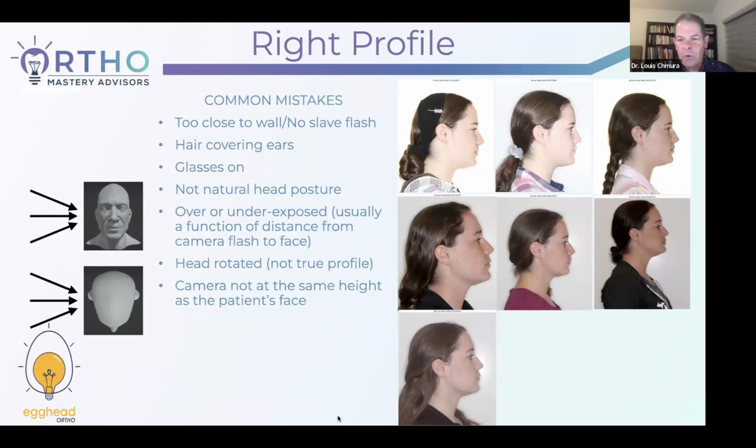I have to go in and resize their head. You can see in the top left photo, well, all the top 3 photos, she is exposed more than the bottom 4. You can see that her head posture changes between the top 3 and the 4th one, but it's different on the 5th, and then it's back to the same on the 6th, and then the last one is still with the head up a little bit.